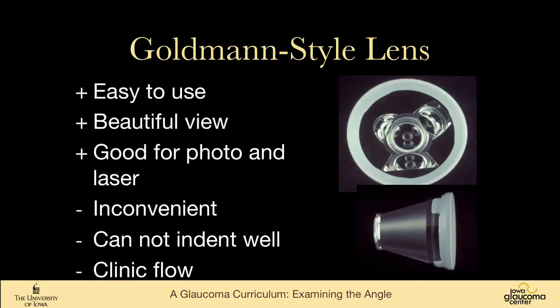So the Goldmann style lenses are easy to use, beautiful view. They're great for photography and laser. So if I'm doing a laser procedure in the angle, I always use a Goldmann style lens, or many of them that are designed specifically for laser use. Or when I want to do videography for my website on gonioscopy, I would use a Goldmann style lens. But they're less convenient. They can't be used really to do indentation with any sort of power at all.